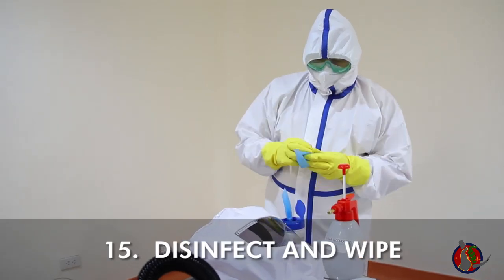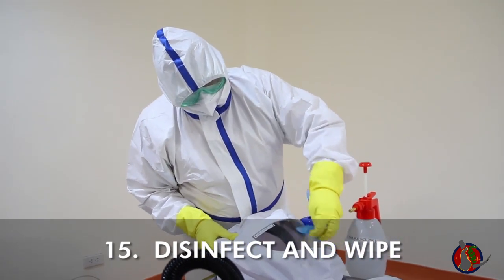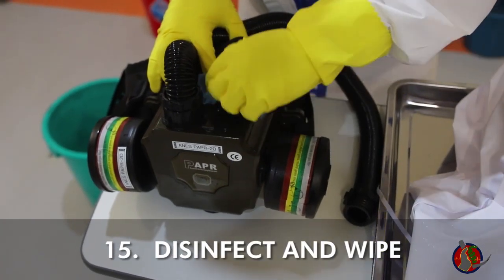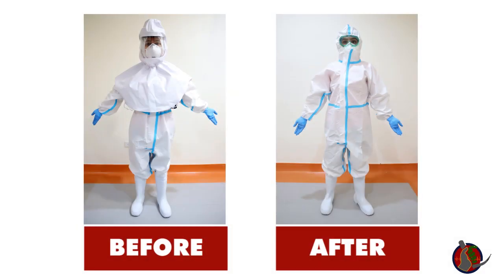With the second layer PPE still on, disinfect all PAPR surfaces and wipe all surfaces. You have successfully doffed the PAPR. Proceed with second layer doffing as per the enhanced PPE doffing protocol.